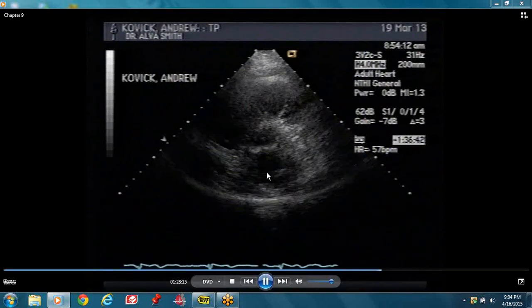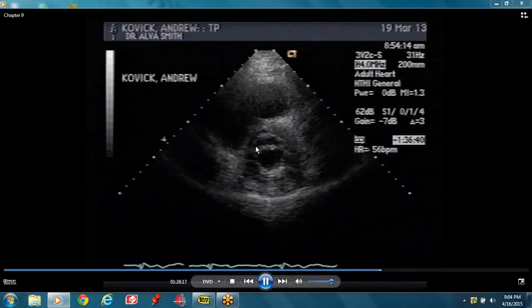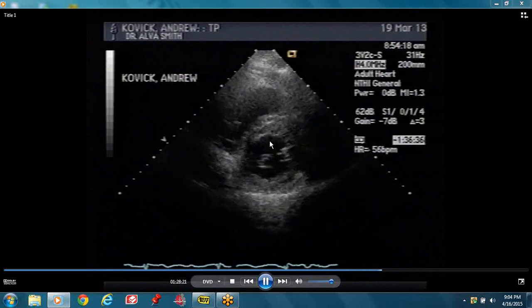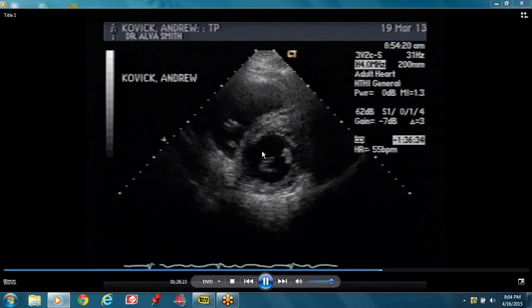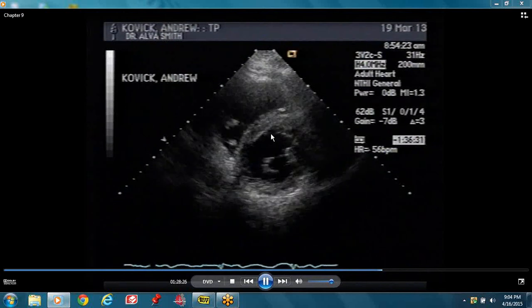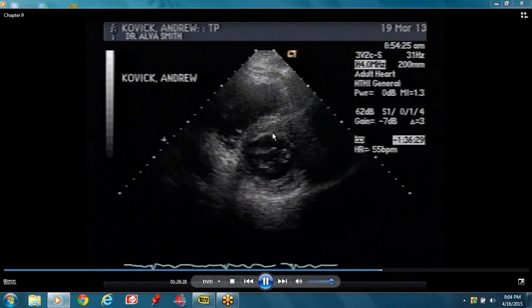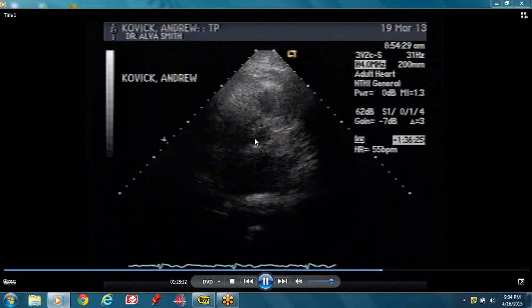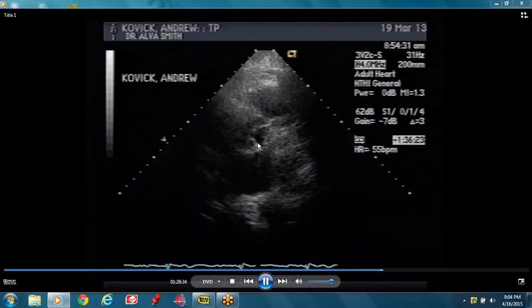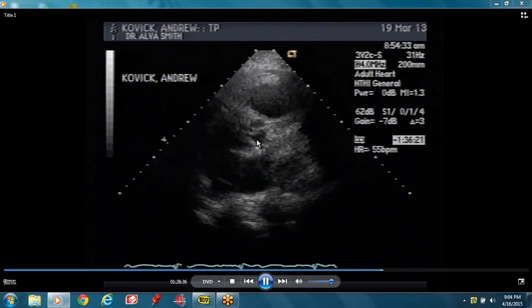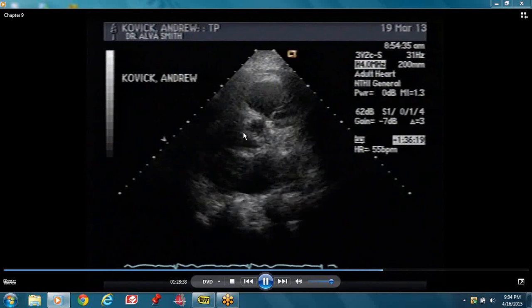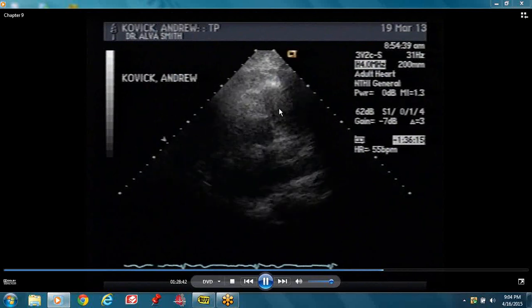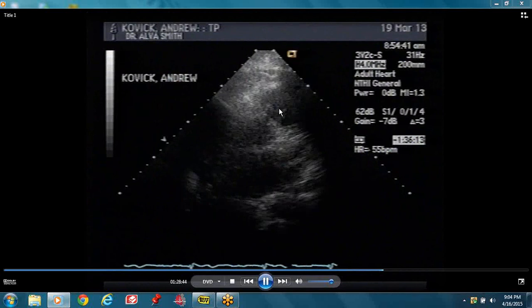It's important for you to look at normal studies to know what a normal study looks like so when you see an abnormal study, right away you know it's abnormal. Short axis — go to the aortic level. At the level of the aortic, you can see three cusps. The valve is not opening to its full extent — you can see that it's thickened, somewhat restricted.